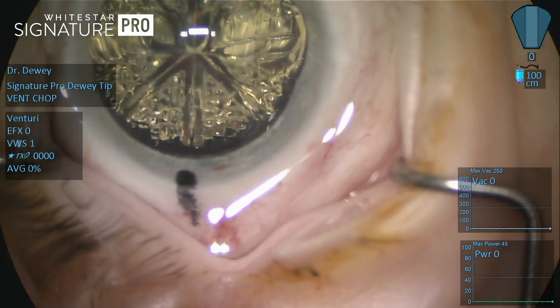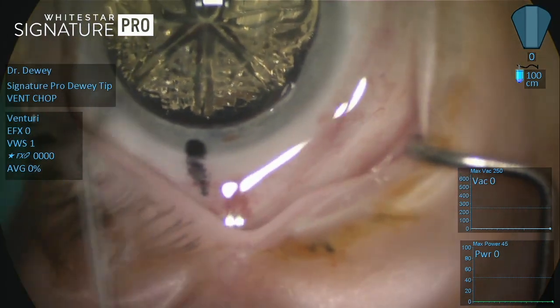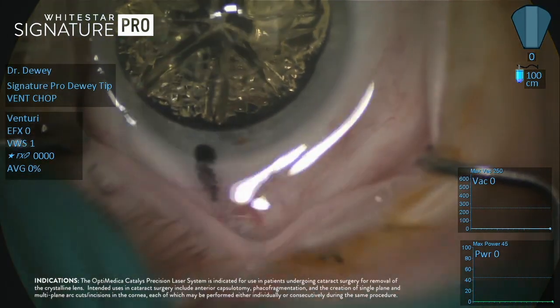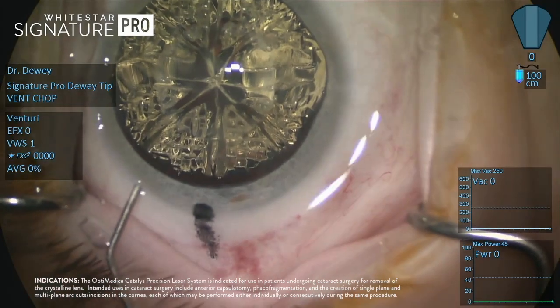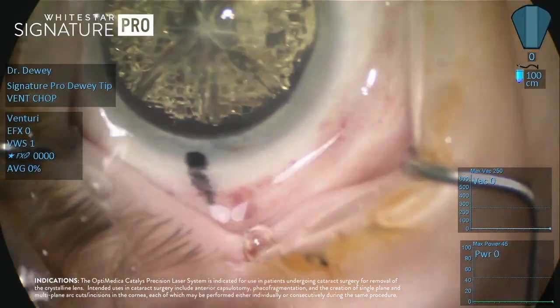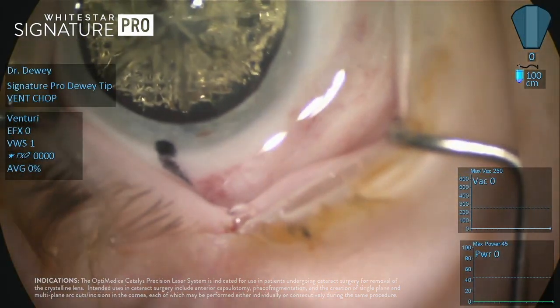This is obviously a femtosecond laser assisted cataract surgery. We've had the Catalyst femtosecond laser now for about 18 months, and find that about 25 to 30 percent of my patients are offered this precision.